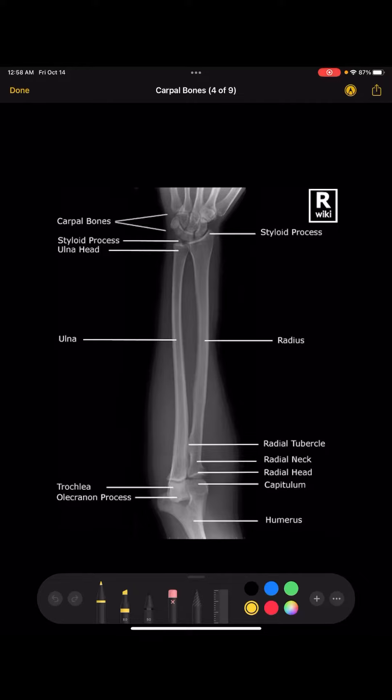You need to make sure that you collimate two inches distal to the wrist joint and two inches proximal to the elbow joint, and make sure that you have one inch on the sides. The carpal bones are going to be slightly distorted just because of the divergence of the beam, but you can still see them nice and clearly.